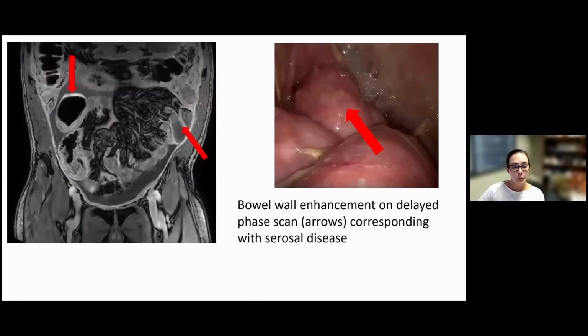So just for the future, we're working together with our team here at University of Chicago, and we are trying to get better ways of imaging peritoneal tumor in general. And with the help of our patients, we've been developing higher resolution MR imaging, trying to outline the exterior wall of the bowel, which in this case, for example, is very thick in the peritoneal lining and the wall of the bowel in the surface where the peritoneal lining is covering it. And we're developing the sequence to try and distinguish very early tumor involvement in the peritoneum.